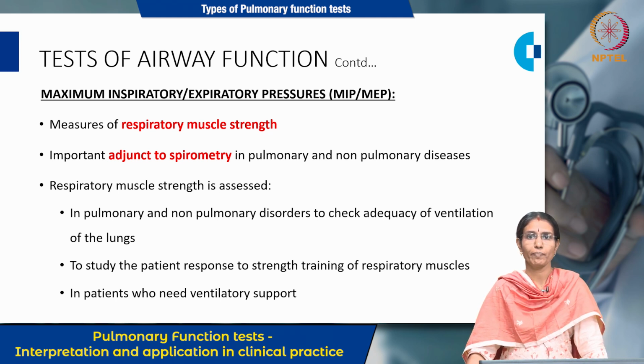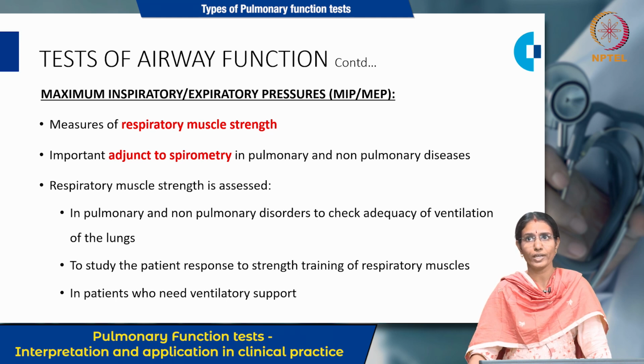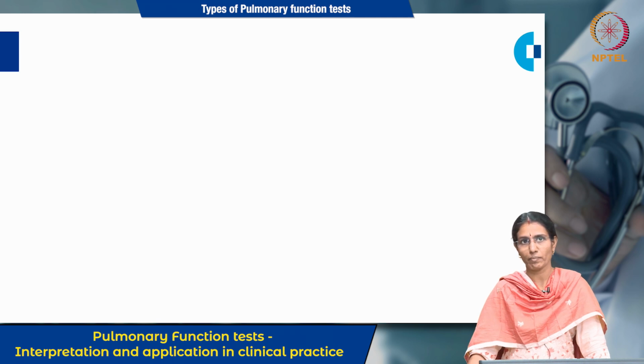And when the patient is started on rehabilitation, patients with poor respiratory muscle strength, when strength training is done, rehabilitation is done to assess such patients, and also in patients who need ventilatory support, such pressure measurements will be very helpful. And how are these pressure measurements done?